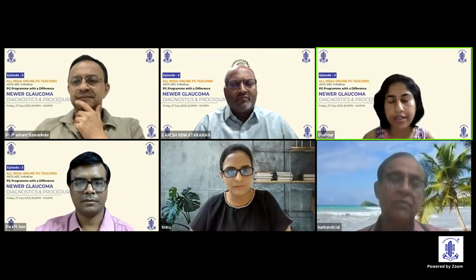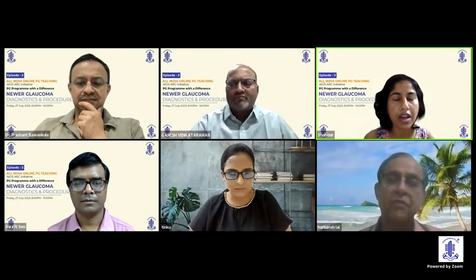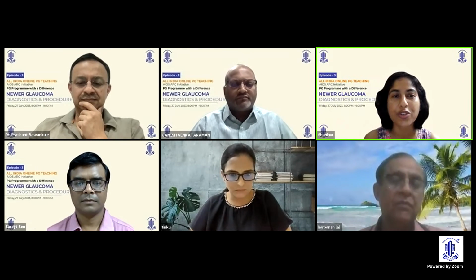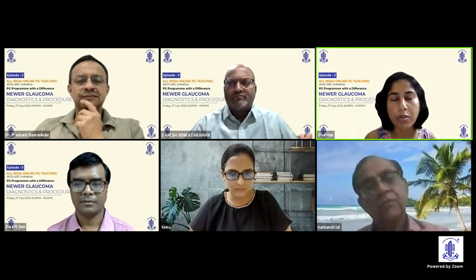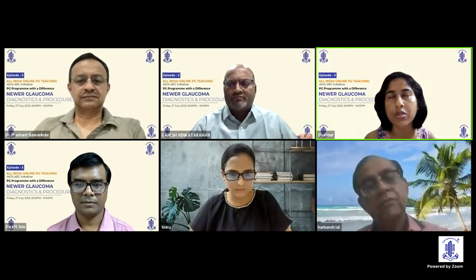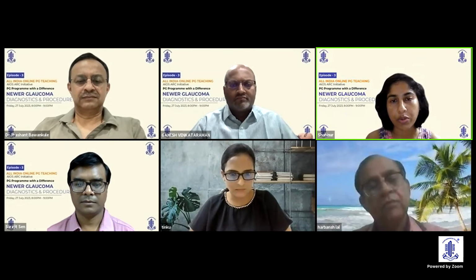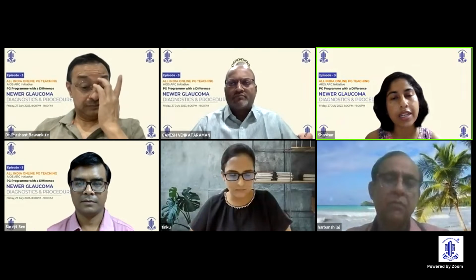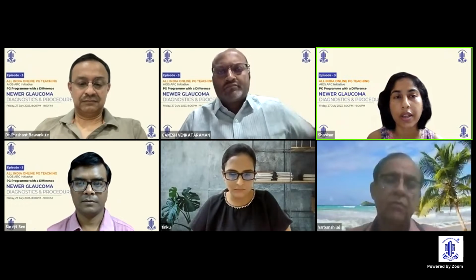Dr. Shahinur? Yes. If it is a glaucoma suspect, then initially in our institute, we are doing routinely the 30-2. It has been going on. So we have not shifted to 24-2. So 30-2, and if everything is normal in the 30-2 and clinically also we find that the disc is looking healthy, then we don't do a 10-2. But if there is even a paracentral scotoma in the 30-2, even one scotoma, then in that case, a 10-2 is done. But routinely for glaucoma suspects, we'll do the 30-2 only.